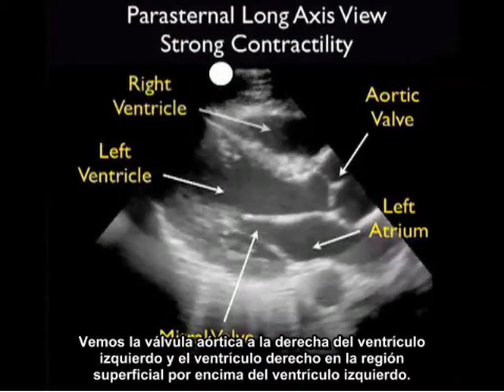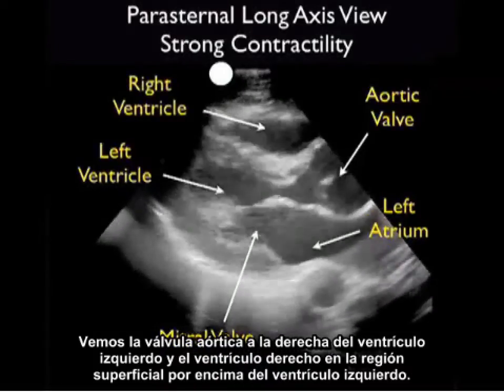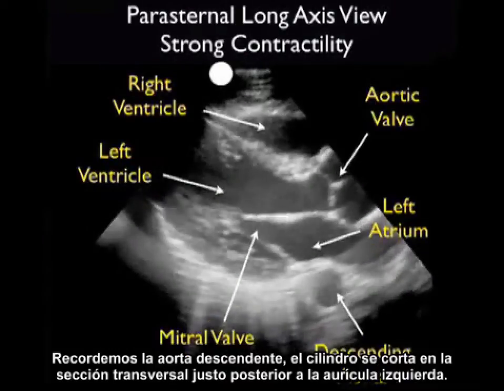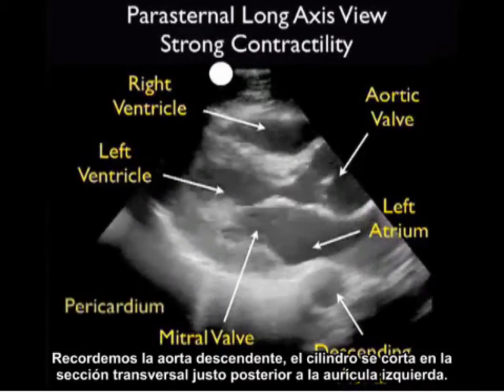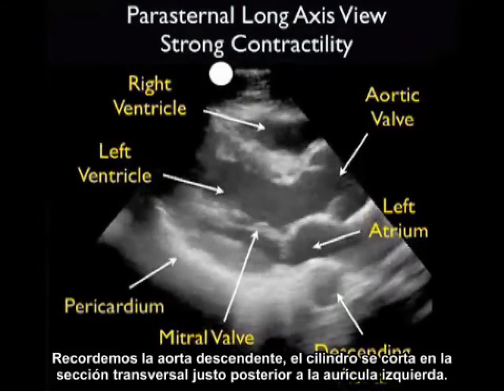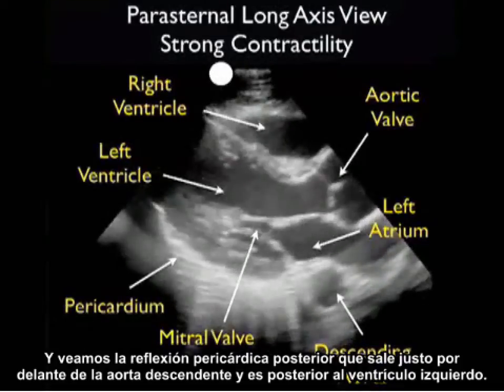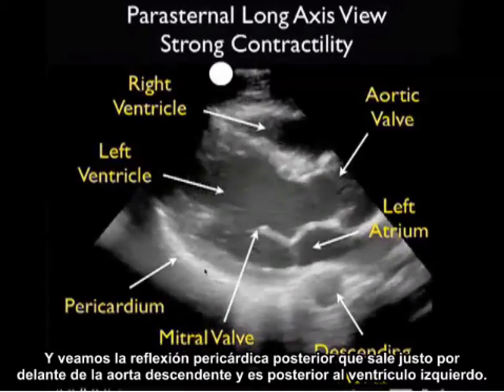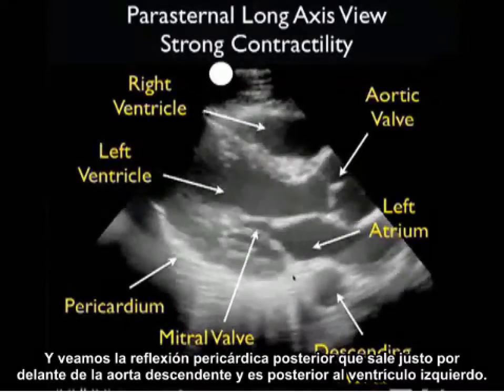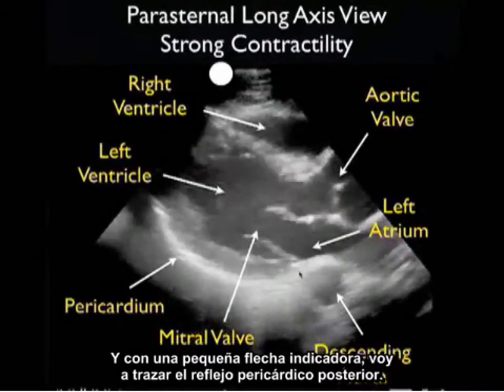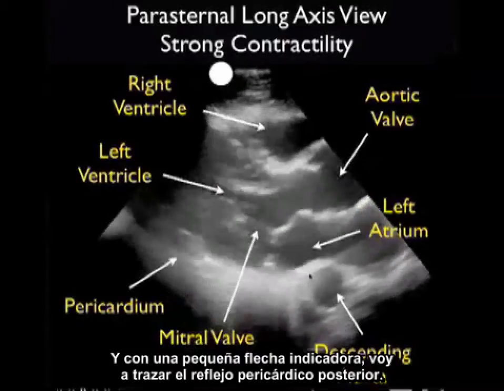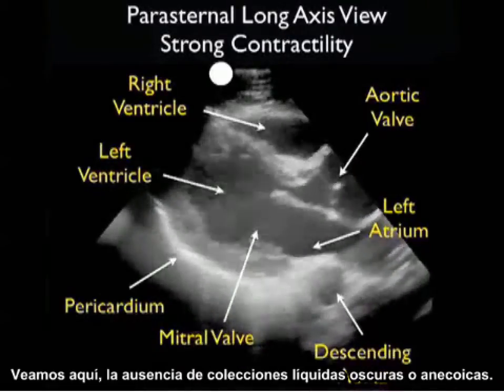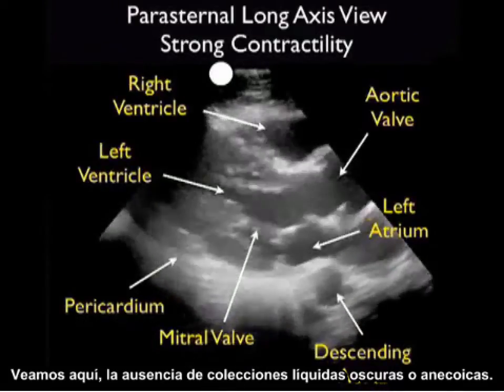We see the aortic valve to the right of the left ventricle and the right ventricle in a superficial location above the left ventricle. Recall the descending aorta — the cylinder cut in cross section just posterior to the left atrium — and note the posterior pericardial reflection coming off just anterior to the descending aorta and posterior to the left ventricle. With a small indicator arrow I'll trace out the posterior pericardial reflection, noting the absence of any dark or anechoic fluid collections.